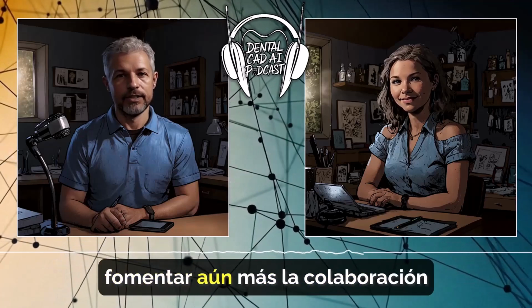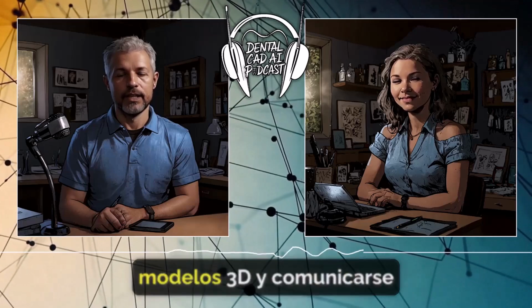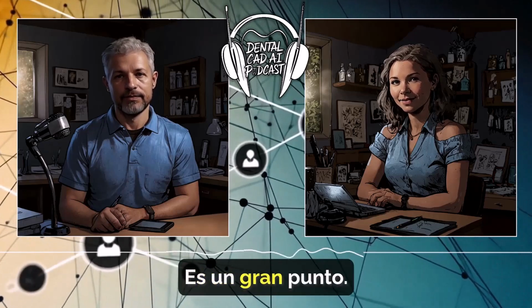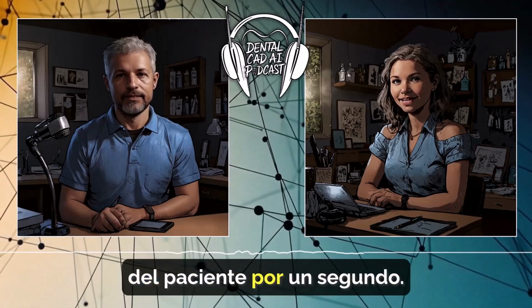That's a great question. I think these improvements are going to foster even stronger collaboration between them. How so? Well, think about it. With the ability to share these detailed 3D models and communicate in real time, it's almost like they're working side by side even when they're miles apart. That's a great point. It's not just about the fancy new tech, it's about using that tech to enhance communication and teamwork. Exactly.